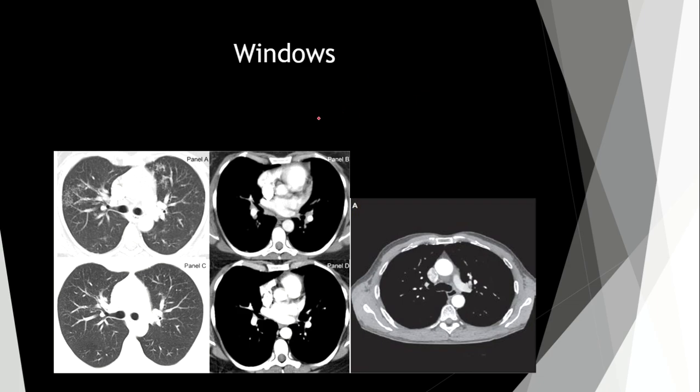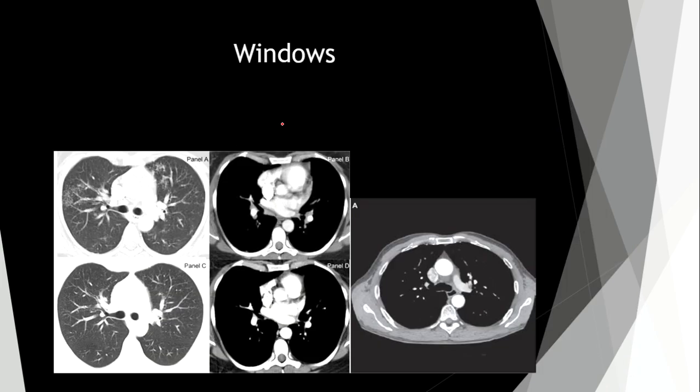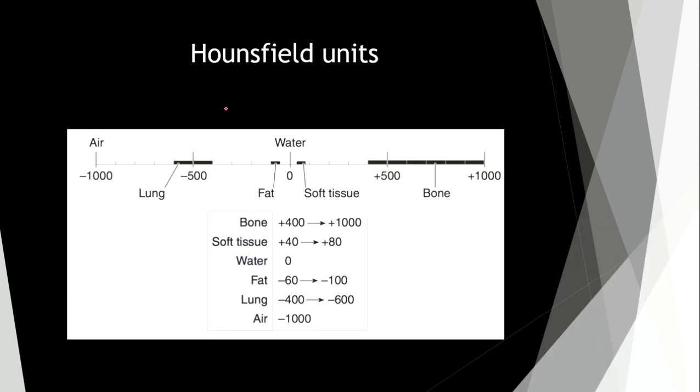And we have to talk about one very important thing. It's windows. What does it mean, windows? As we saw before, we have different Hounsfield units.